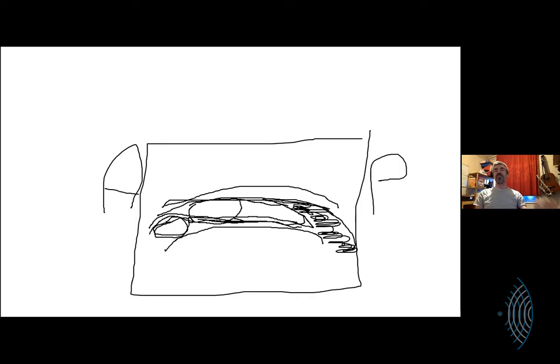I just wish that I could experientially say, yes, I know exactly what that is, but I will look for it now. As I come proximal off the greater tuberosity, I start to see the meat, or the fiber, of the supraspinatus. I will look for the long axis orientation of the fibers. You'll see them rock up here, and you'll see them most clearly when you are absolutely 90 degrees to this. So the brighter the anterior component is, the greater the likelihood that I'll see the differentiation of those fibers. Yes, because when you are really pedantic, they show up quite nicely.